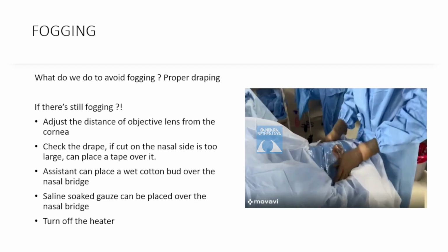When it goes too eccentrically, and if a large part of the blue drape is across the bridge of the nose, that area gets lifted up very easily because it is stiff. It is not like the plastic drape. And whatever you do, the plastic drape gets lifted up because a thick plastic is keeping it lifted up. So the circle should be totally around the eye and onto that side of the bridge of the nose, not on this side of the bridge of the nose. Okay? So that's why I said open it up and stick it. Don't stick it and open it.